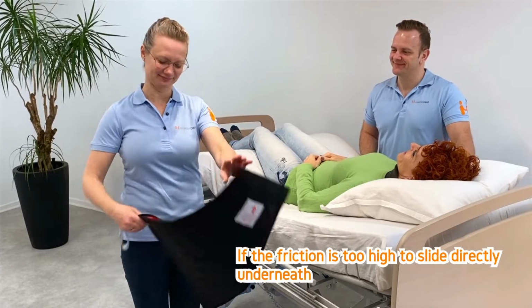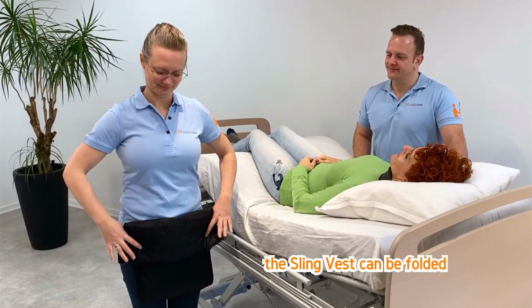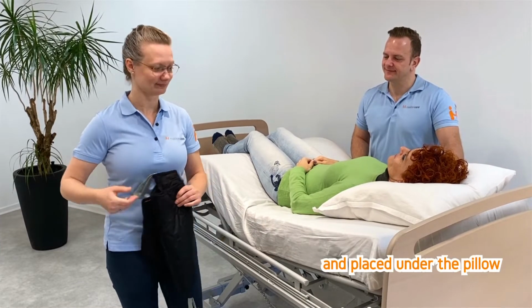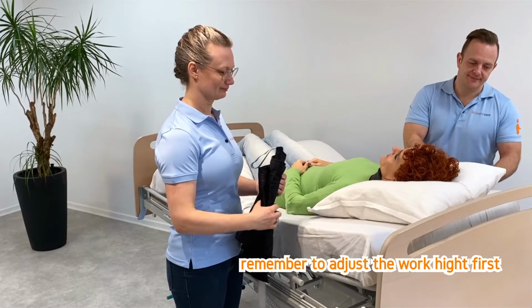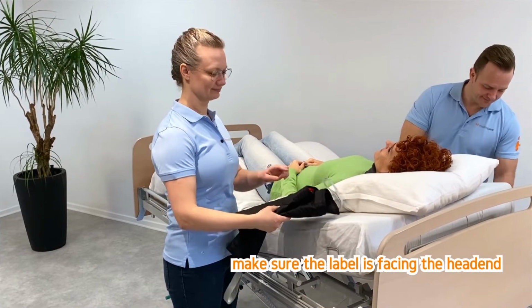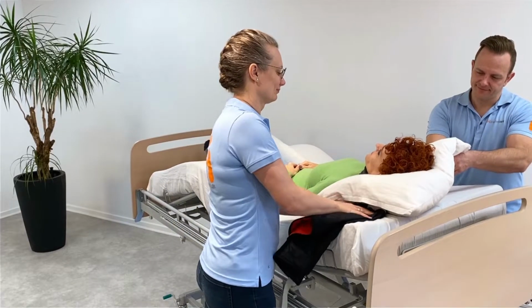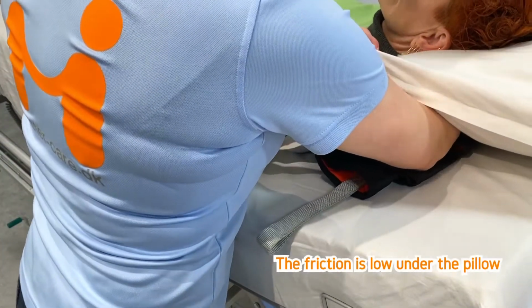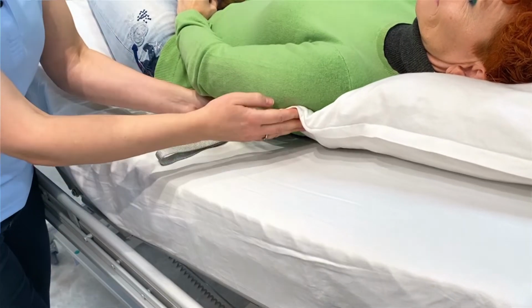If the friction is too high to slide directly underneath, the sling vest can be folded and placed under the pillow. Remember to adjust the work height first. Make sure the label is facing the head end. The friction is low under the pillow. This makes it easy to unfold the sling vest.